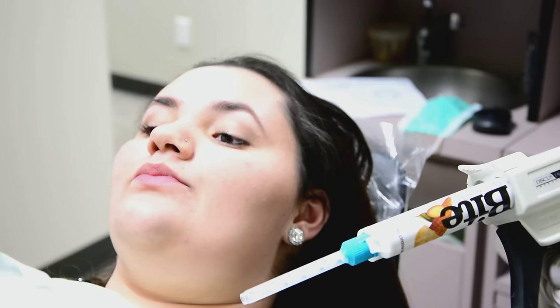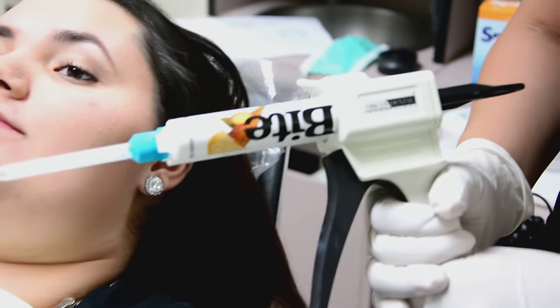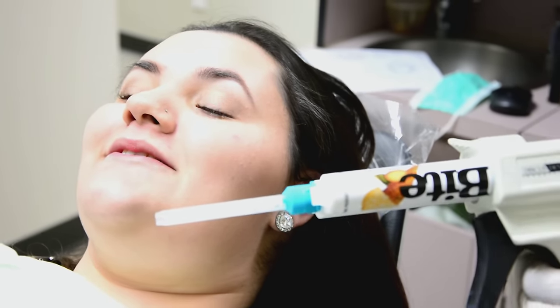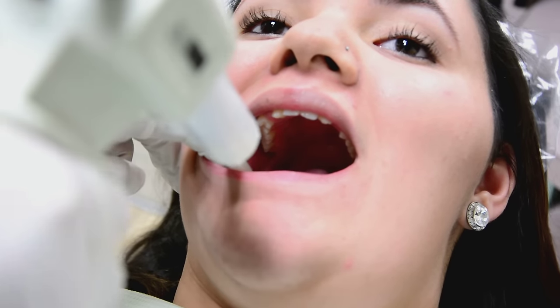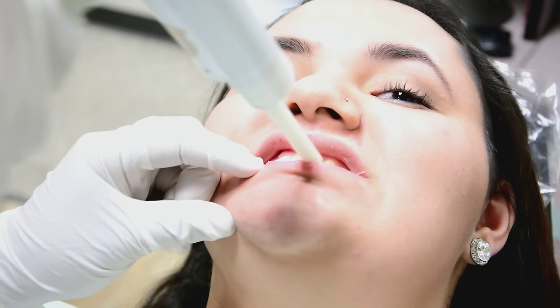The next step is to take the bite registration material, which is really important so we know how the teeth fit together — and it's important for the lab. We use Denmat's bite registration material, which comes in great flavors. The assistant places the material over the occlusal surfaces of the lower teeth, the patient bites down, and you can add a little bit of excess just to make sure you establish an accurate bite.